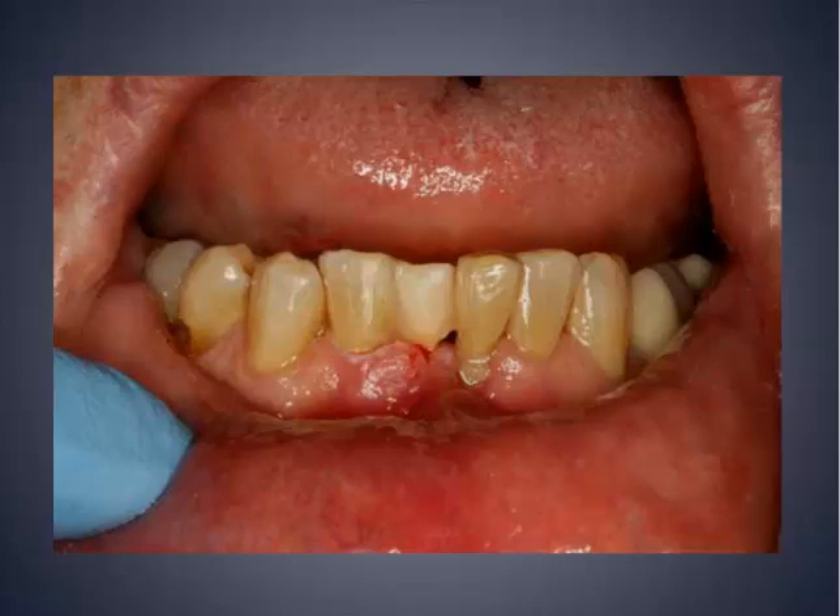Here's the completed case. Is it the most aesthetic, gorgeous tooth in the world? No, but remember her lip is going to be covering this tooth. For this 85-year-old woman, she will walk out and function and look good, be able to smile without having a space there, and without committing to expensive dentistry. I think I'm doing this patient a tremendous service. This took me about 20 to 25 minutes, partly because of the patient's condition. I would charge between $400 and $600 for a procedure like this. Your cost of material is very, very low. They hold up pretty well — I have not had one of these break on me yet, and I've done a good number of these over the past year.